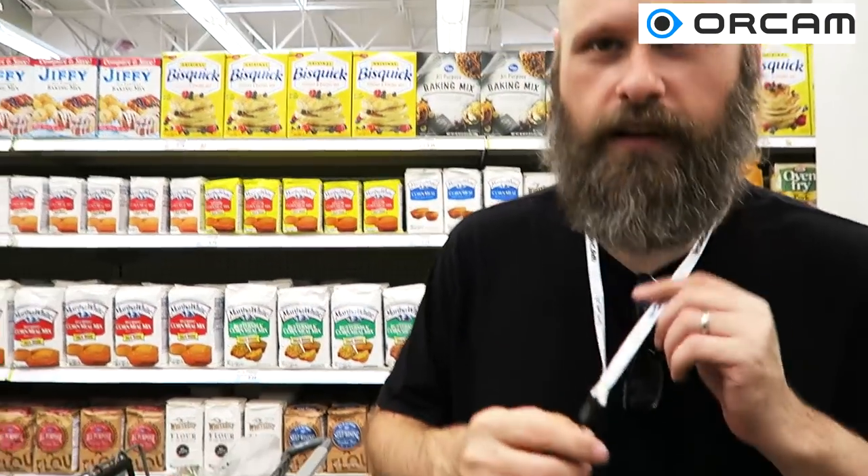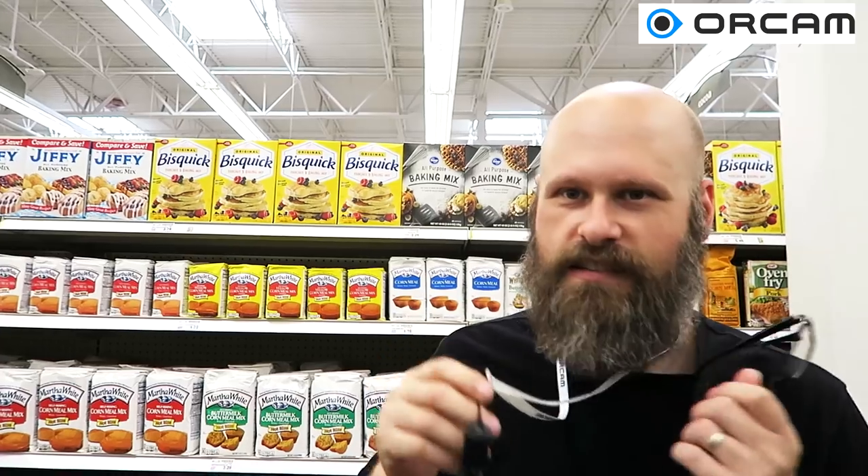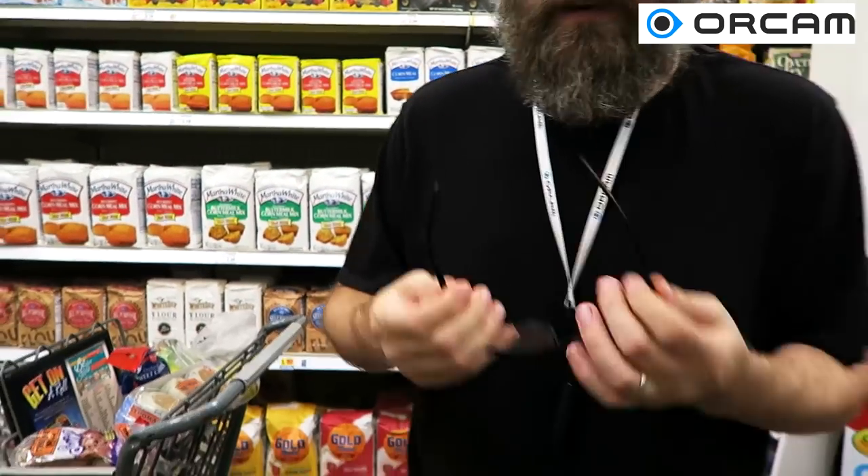So it got it. Once I took it away from all this other confusion, it did a pretty good job. One cool thing about this is since it has the lanyard and it's magnetic, I can just walk around with it hanging on my neck and then whenever I need it, put the glasses on and attach it.